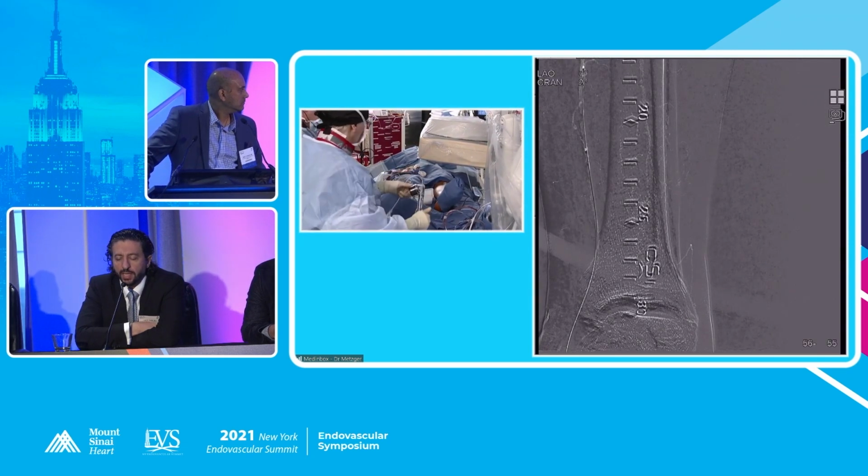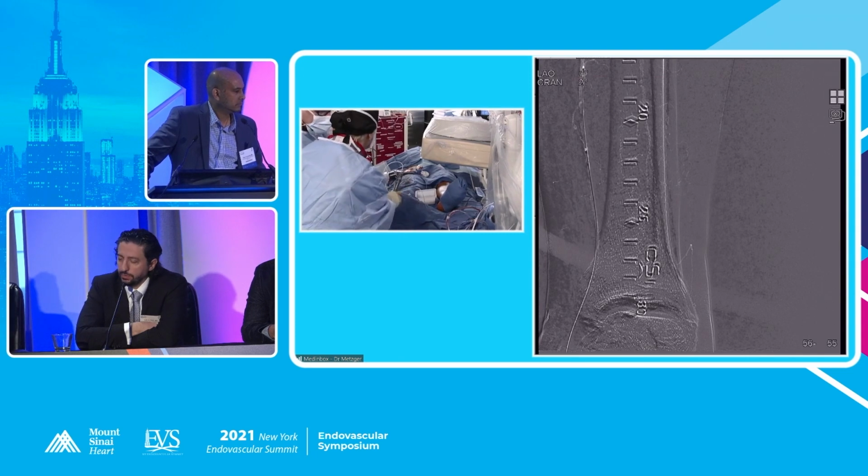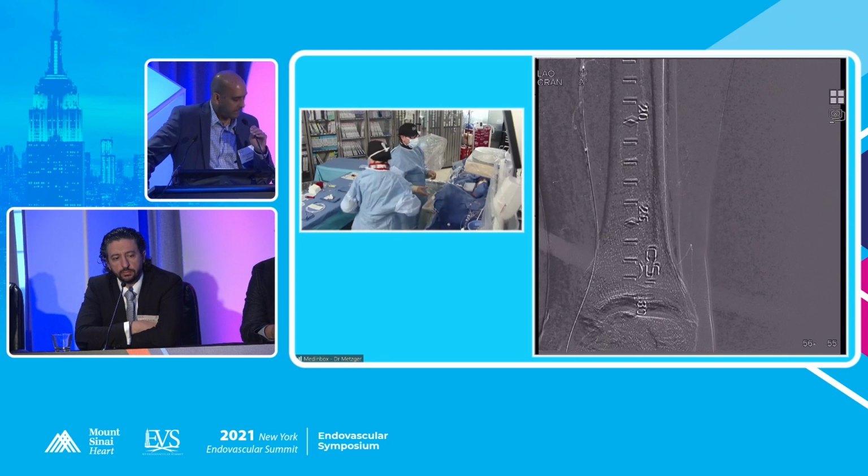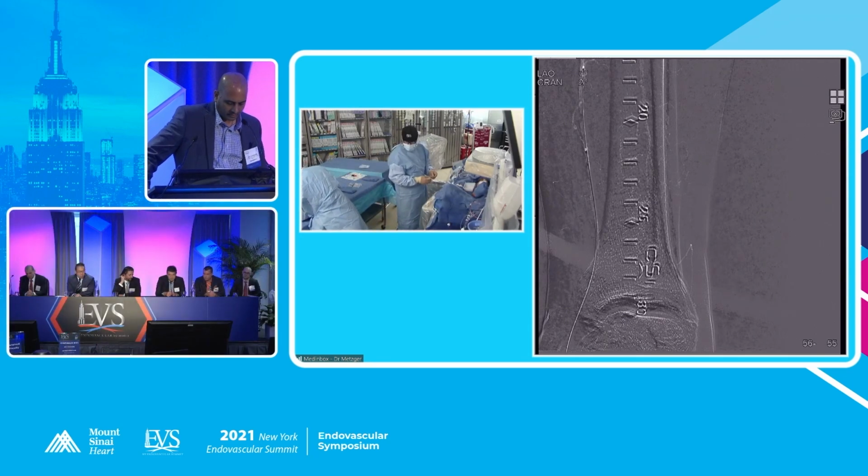So TAMI might not be ideal because of the location of the disease. It seems to be distal and plantar. How about Dr. Babaev? Would anybody else do something differently here?